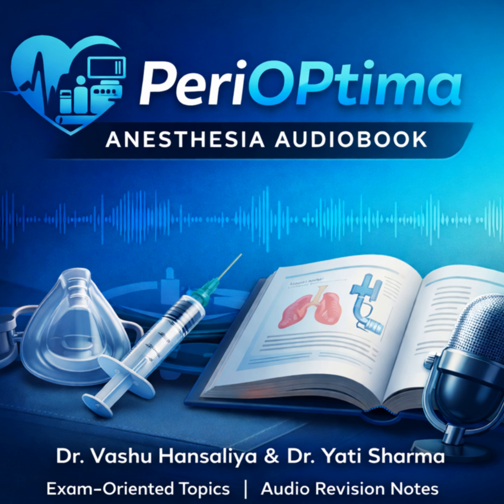So physiologic benefit number 1, increased myocardial oxygen supply. Correct. And on the waveform, which you should be able to draw, you see a diastolic peak that is often higher than the patient's own systolic pressure. It looks really dramatic. Okay, now phase 2.